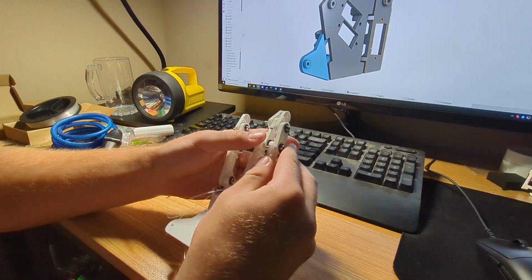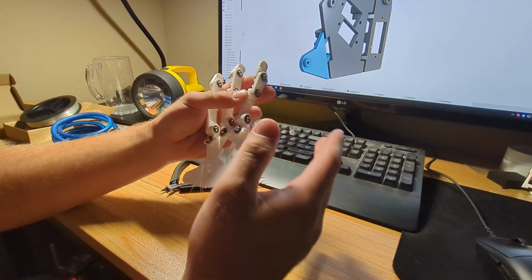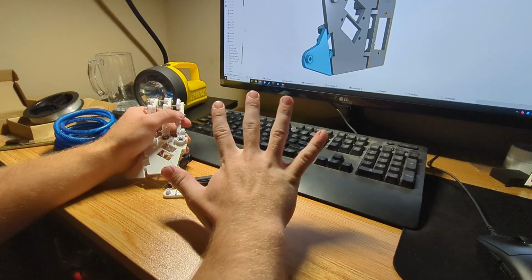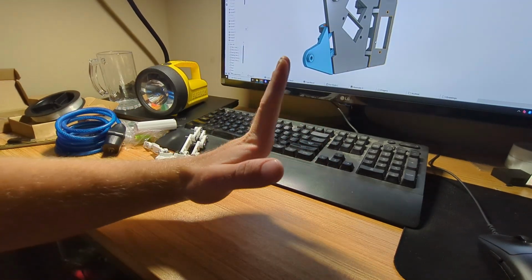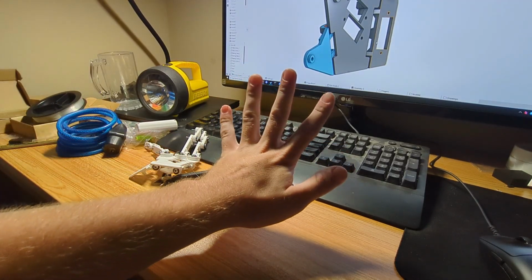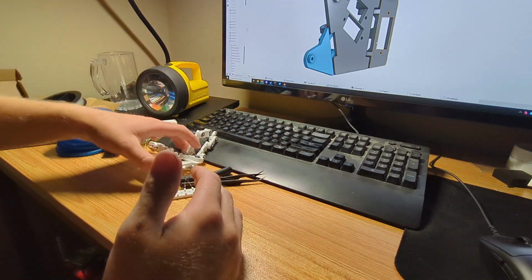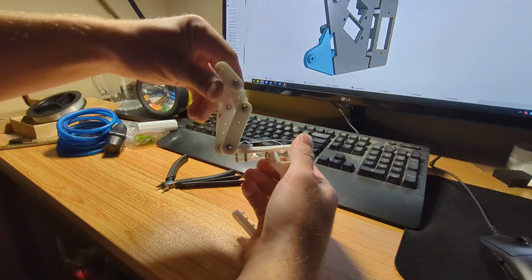The only other thing that I really wanted to modify with this version that is in the print itself is going to be the way these finger joints are structured. So you'll notice with your hand, you can splay your fingers, moving them apart from each other, and you have good control of that, right? You can also lift your fingers back. My fingers can move back pretty far. Now, if you move your fingers back and splay, they move naturally and how you'd expect, right? They continue to splay.